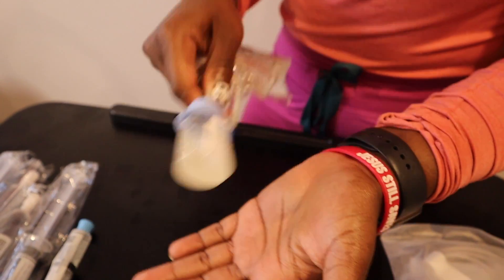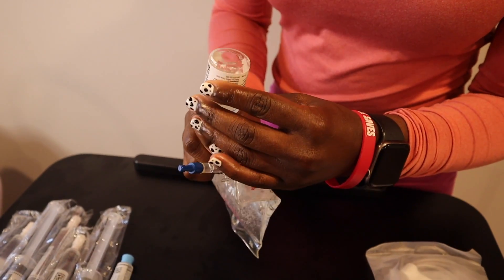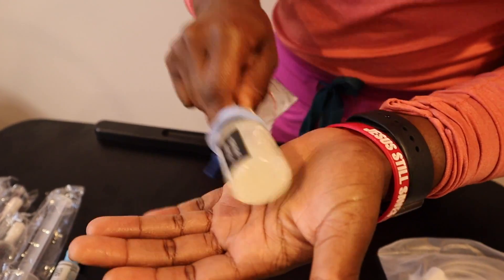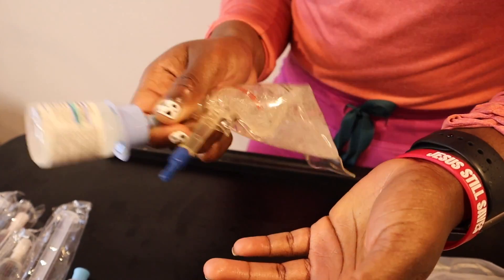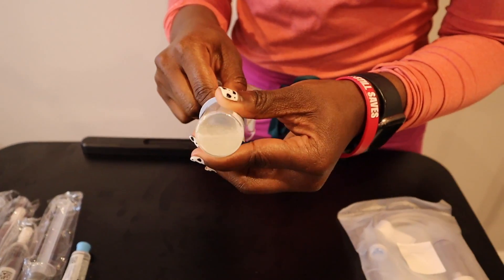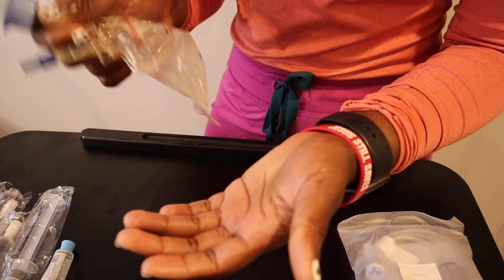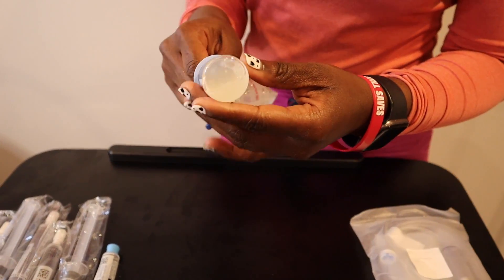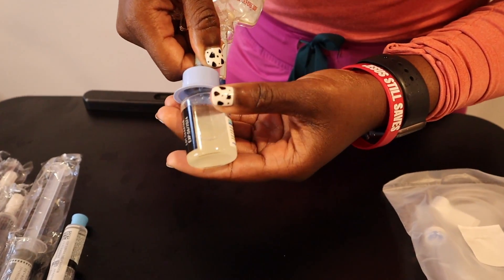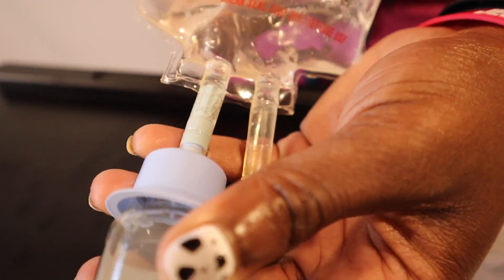Let's start to mix and shake — give it a nice twirl. We want to mix the solution with the powder until the powder is fully dissolved inside of the solution. Shake, slap it on your hand, do whatever you need to do to make sure the solution fully dissolves the powder. You should not see any clumps; if you do see clumps, you should keep mixing. Now as you can see, the powder is fully dissolved into the solution, so we are ready for our next step.